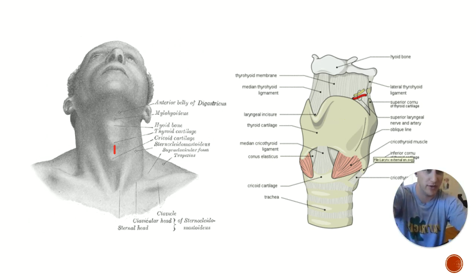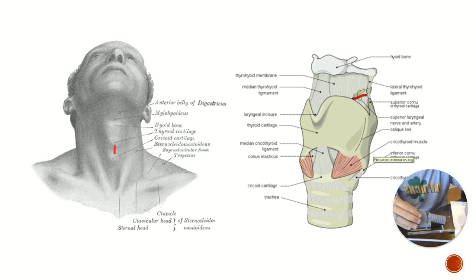What you don't want is that thing slipping around like a slippery fish while you're trying to cut, and there's shooting happening, and everybody's freaking out, and the person's dying. You may know this person. So, claw hand, stabilize the larynx. You have your right elbow, your dominant hand and forearm, on their chest.